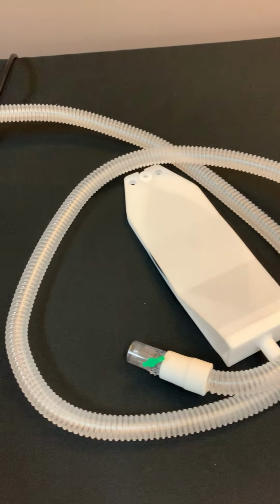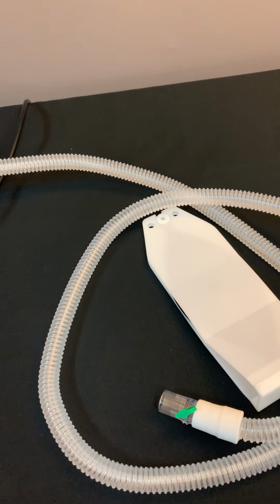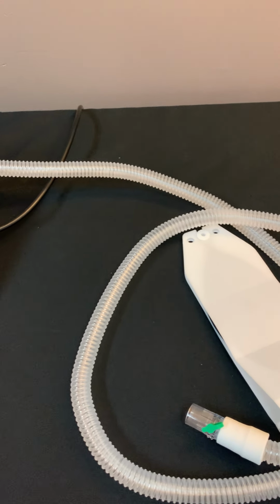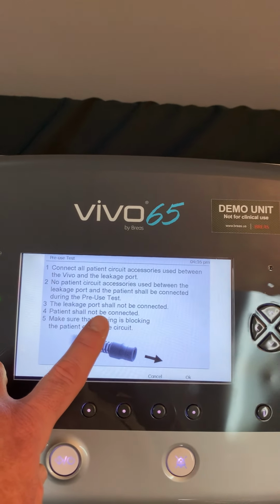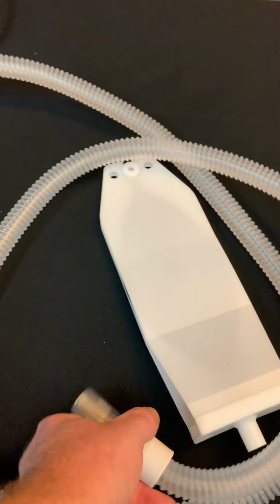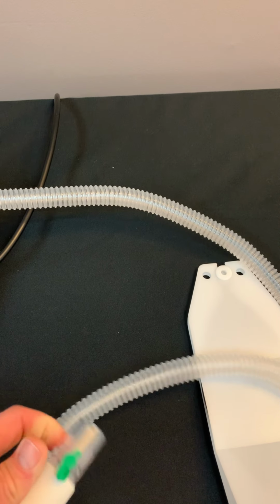So basically what that means is that if you've got a non-invasive interface, or you've got an inline suction catheter for a trach patient, you do not want that stuff connected. Number three, the leakage port shall not be connected. So in this case, we're going to go ahead and just remove that leak port.